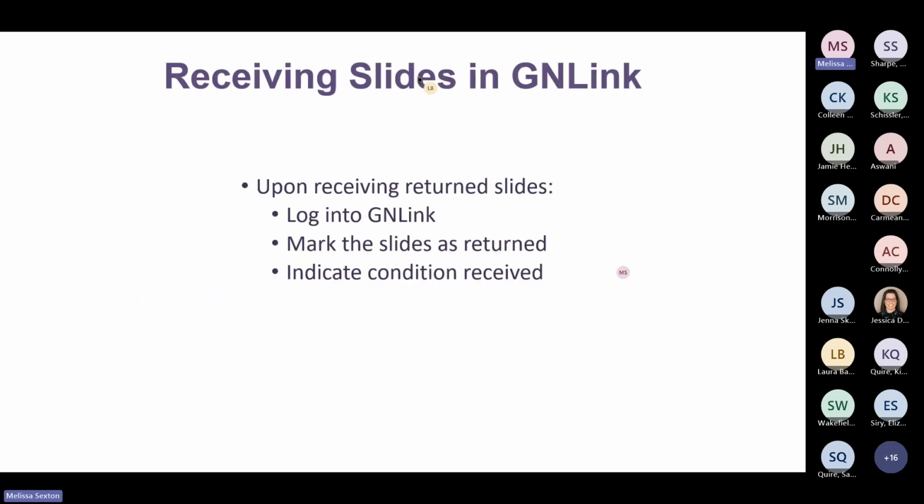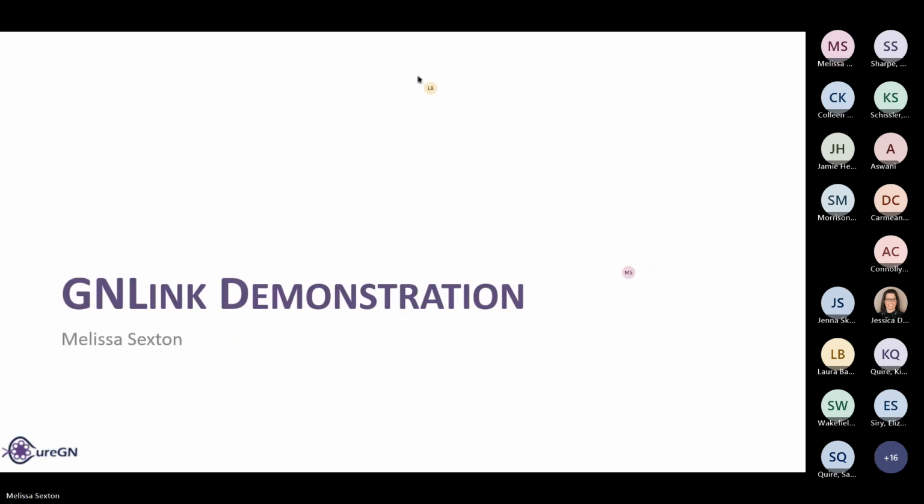So when you receive the slides back, you do need to enter into GN Link that you completed them. So you'll have to log into Link and then mark the slides as returned and indicate the condition received. And we'll show you that in a little bit. Right now, any questions so far?